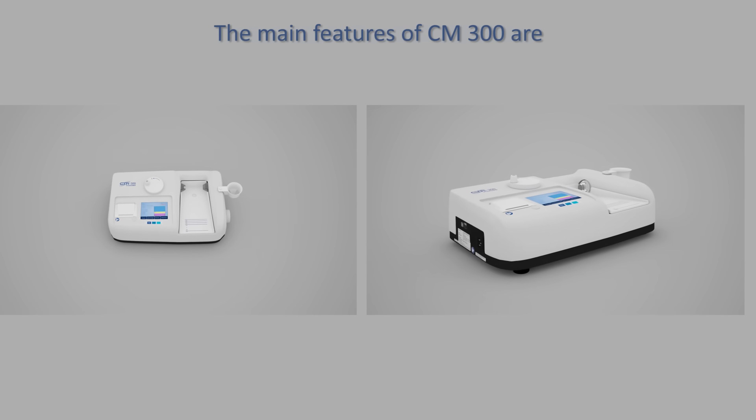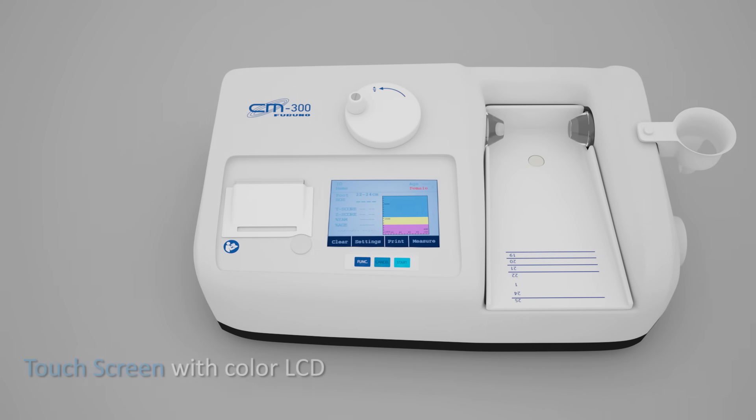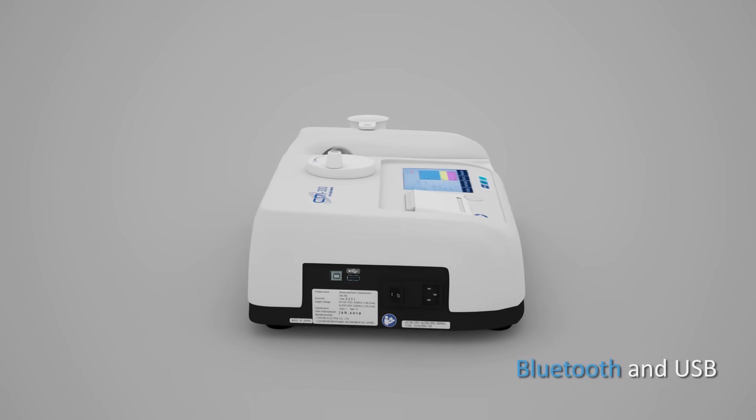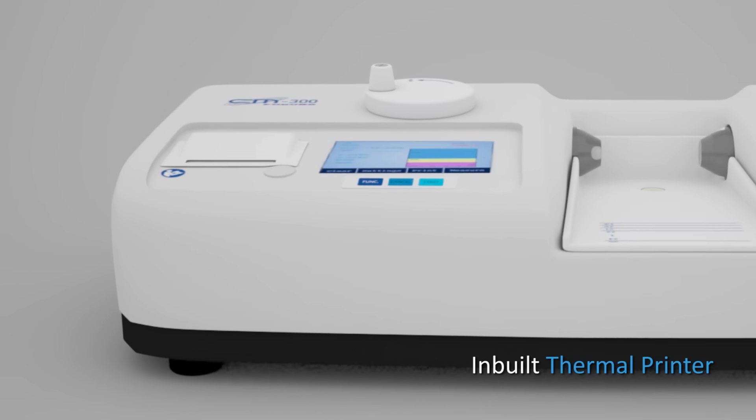The main features of CM300 are: touch screen with color LCD, data storage function, heel temperature sensor, Bluetooth or USB connectivity, and adjustable footplate.